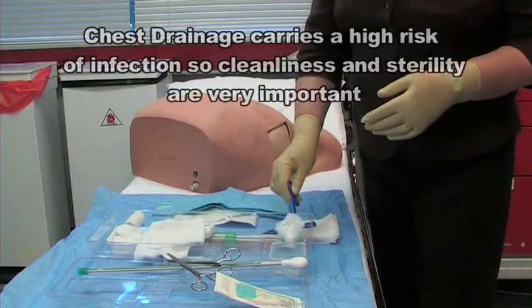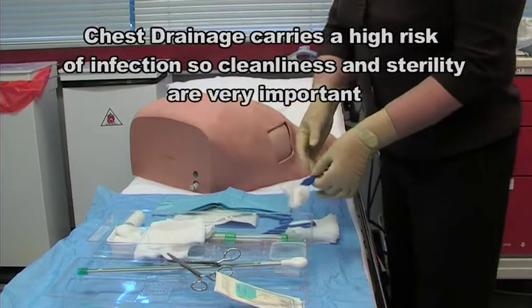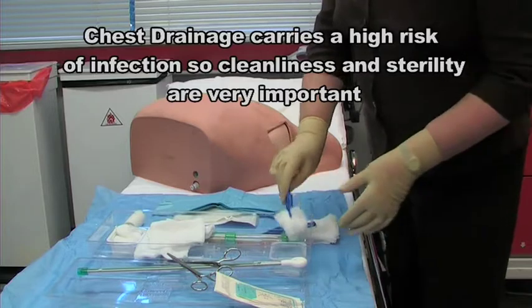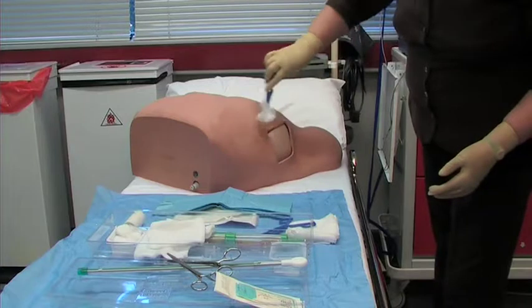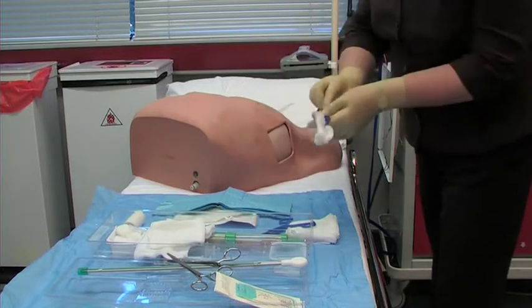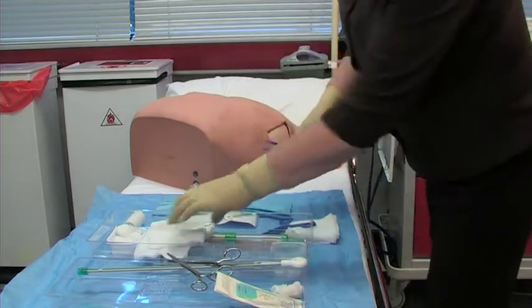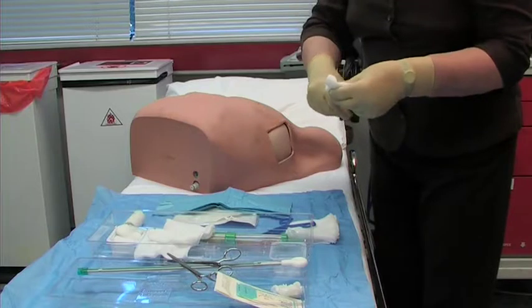Remember, this is a sterile procedure. Our next step is to swab down the area that we're going to be working on, and repeat this two or three times.